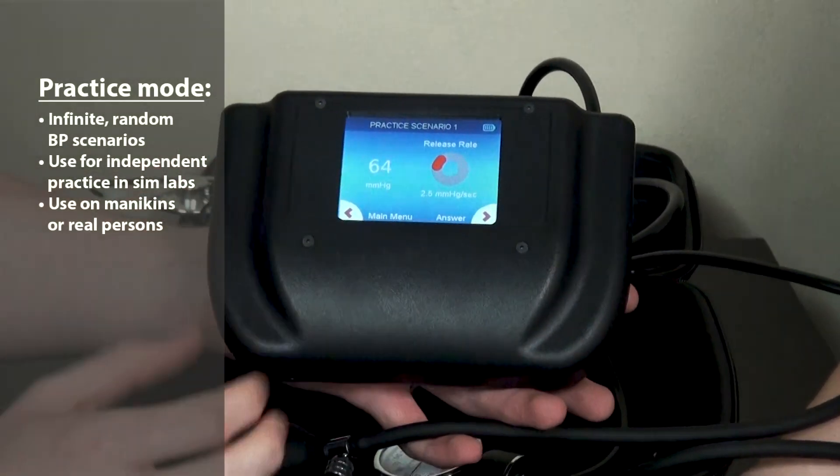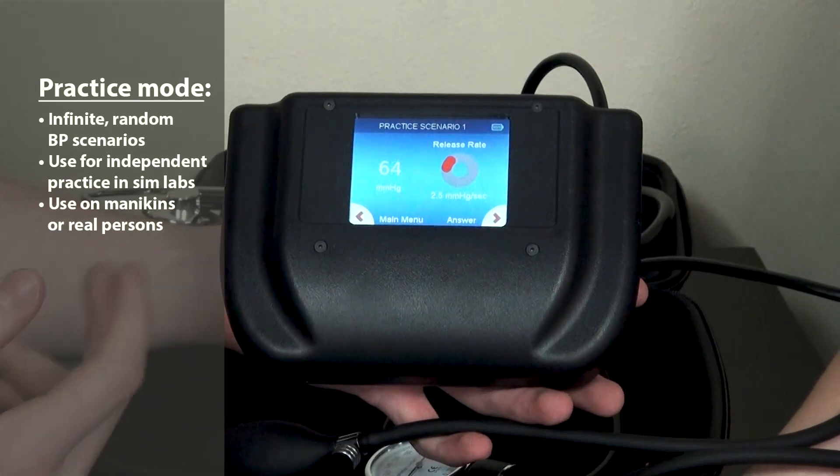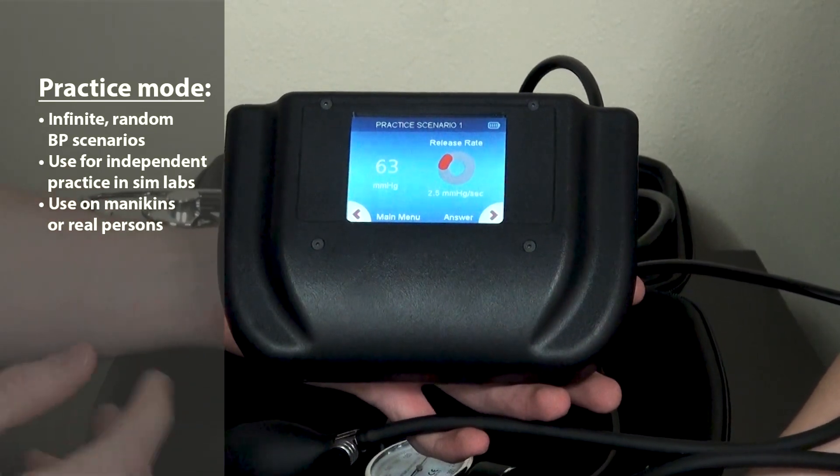The practice scenarios allow the student to visualize low blood pressure, high blood pressure, or a normal blood pressure.